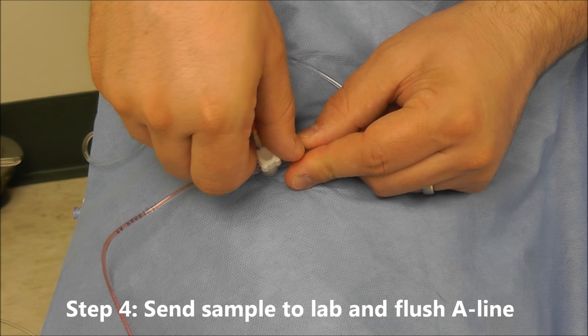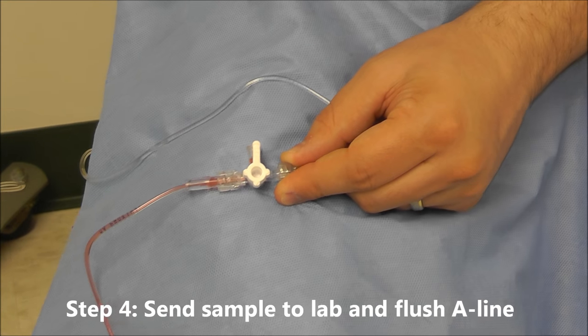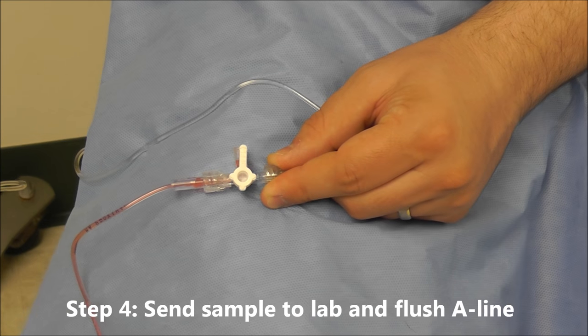I'm going to turn the stopcock off to air, remove my sample, send that to the lab, and then I'm going to flush my system.